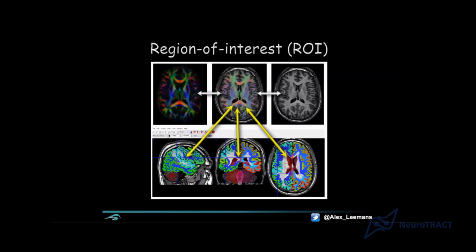That on its own is already quite valuable and can provide very useful, insightful information about disease progression or specific patterns, like looking at the inward-outward gradient of change or things like that, right? If you take that to the extreme, where every voxel is its own region of interest, then we would be looking at a voxel-wise analysis, okay? I will not go into details in this workshop, but it's another approach.